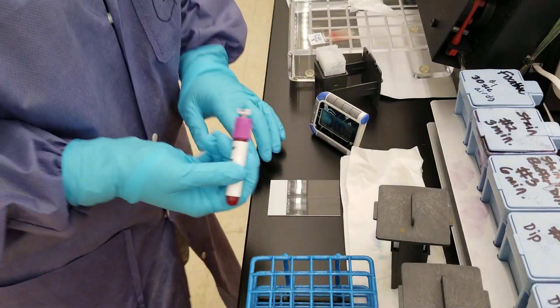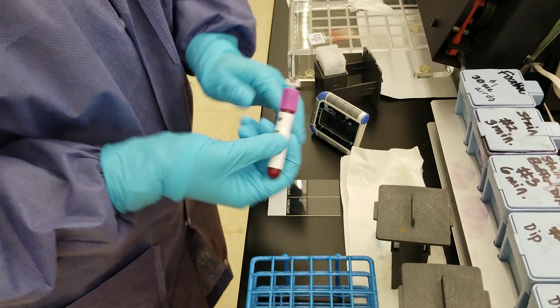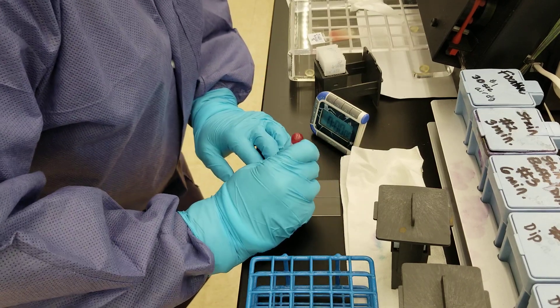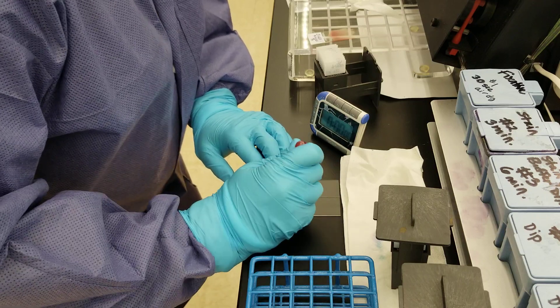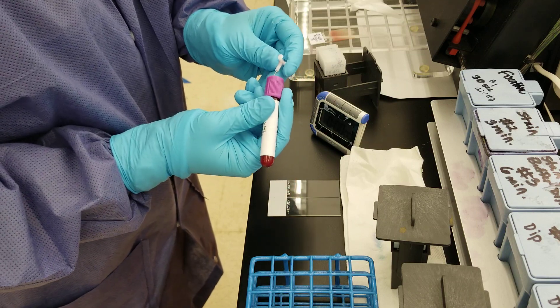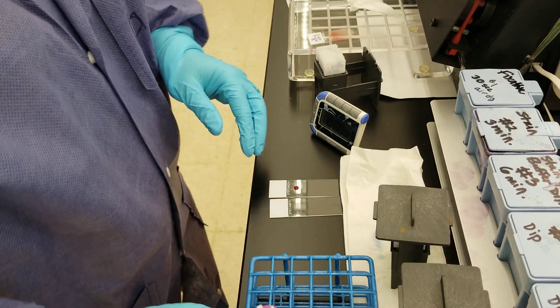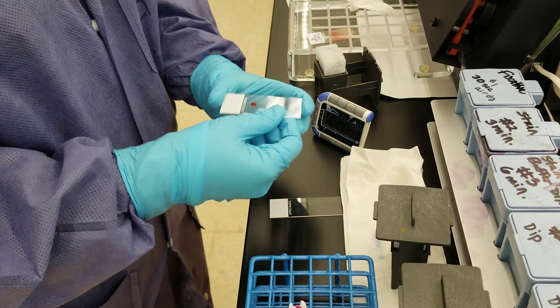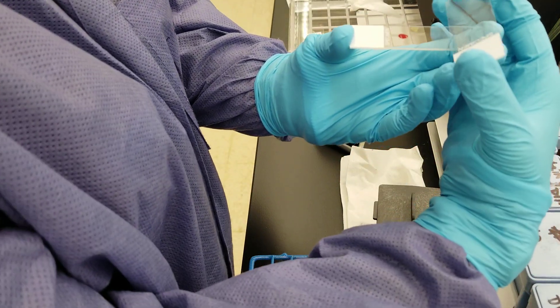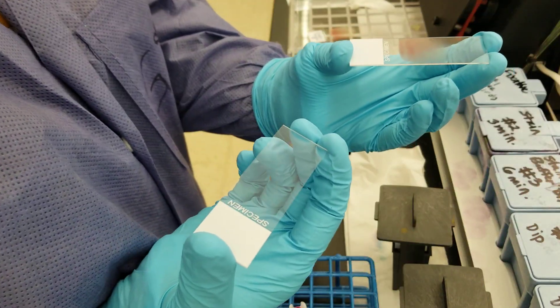Everyone, today I'm following up from yesterday. There was a problem with you seeing the spreading part of the peripheral blood smear slide preparation, so I'm going to start the staining video off with that. I need to get my device working. There's my drop of blood that I'm going to spread.